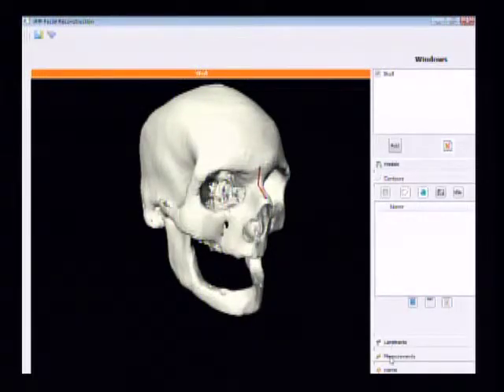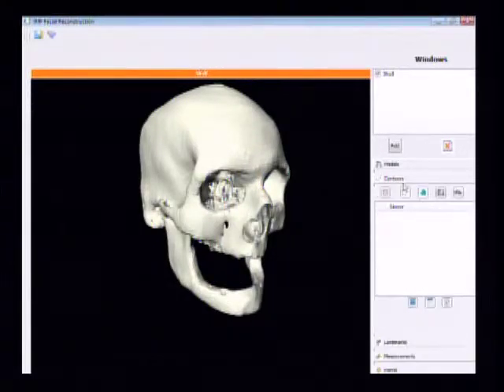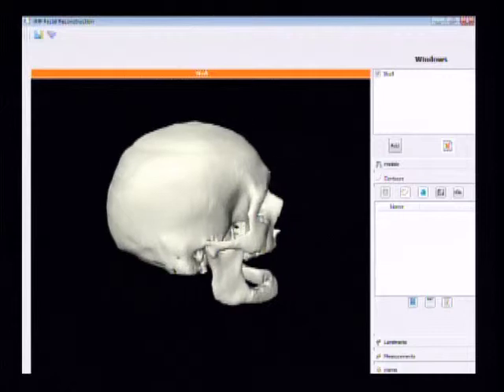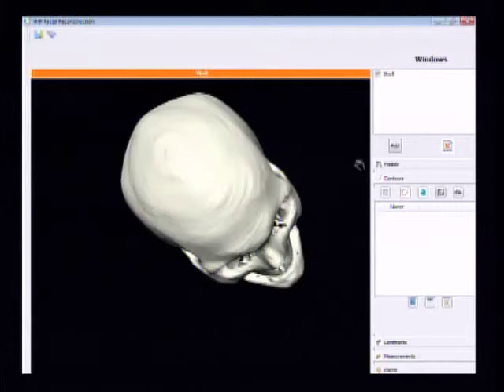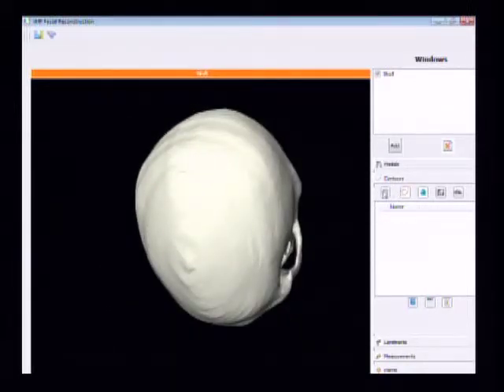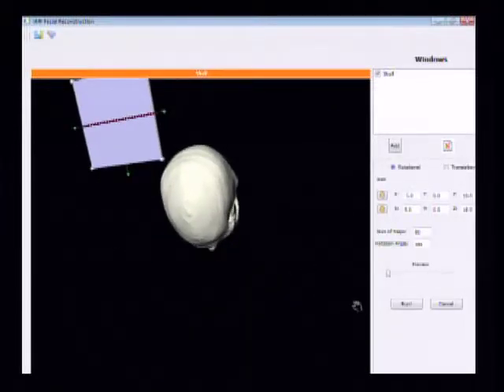There is also a very useful tool that we use under analysis in general, called the contour tool. What it does is slice anatomy in a certain direction. Let's say you want to look at the cross-section of the skull in a certain direction. If you click on the contour tab and hit the first button here, it will ask you what kind of contours you want.